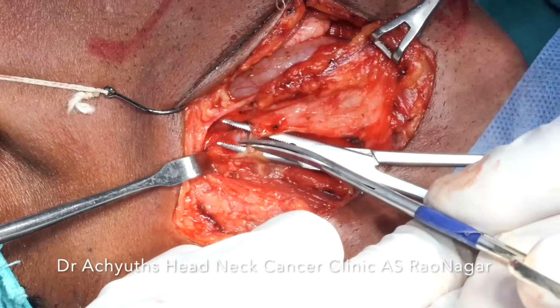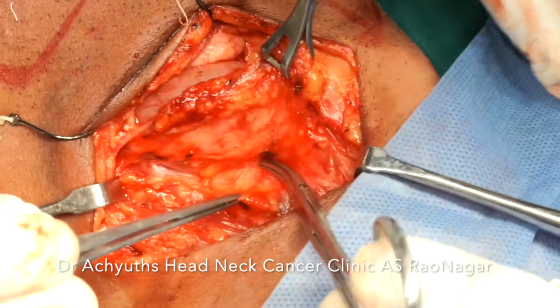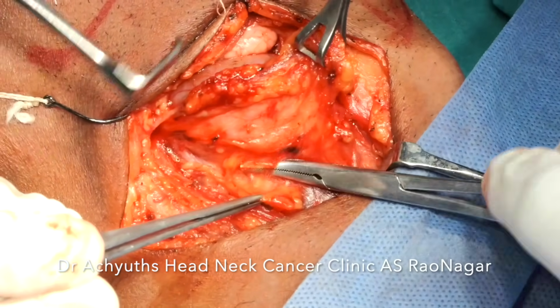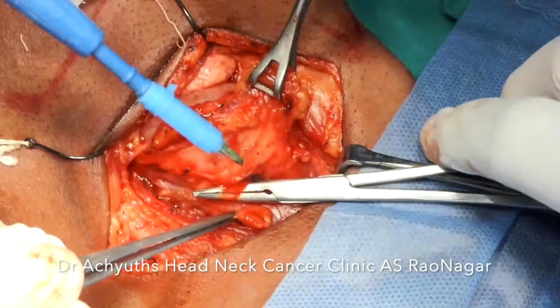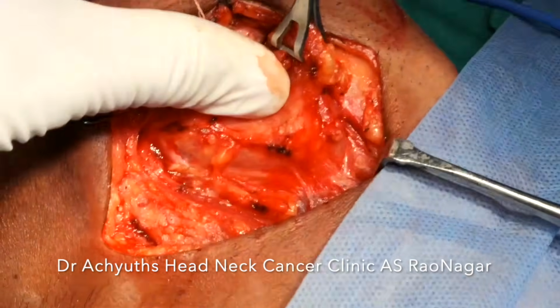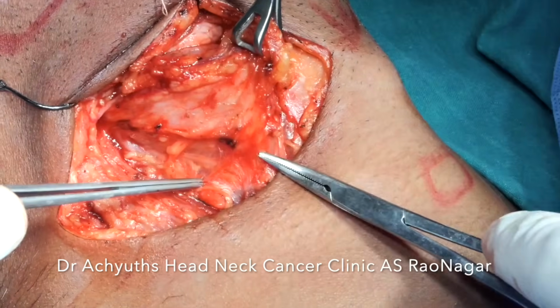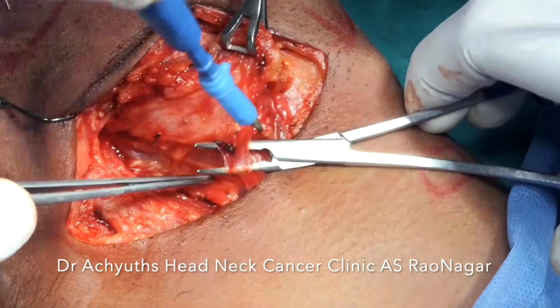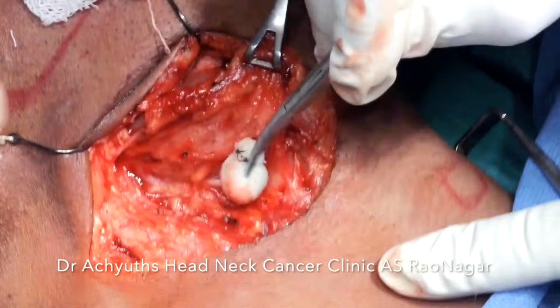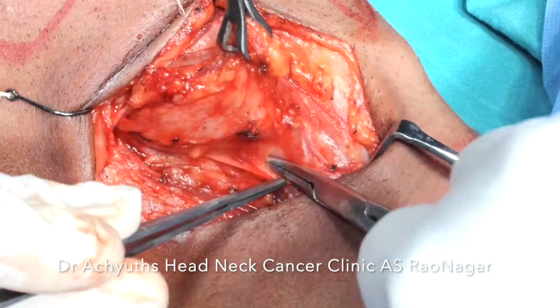So as I told you, when we are doing layer by layer, we usually see any vascular structure or neural structure, and since this is not a radical resection, we are supposed to preserve all the vasculature and all the neural structures wherever it is possible. And it is very much possible that we preserve all these neural and vascular structures also.